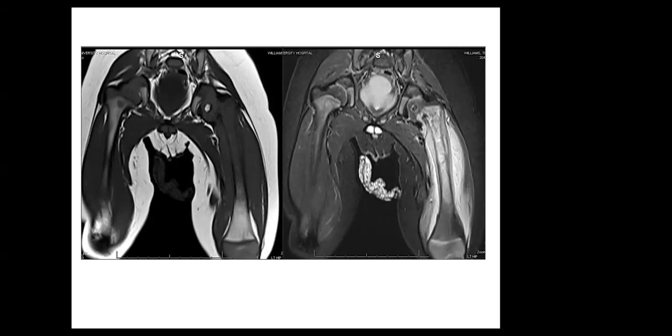Okay, we have 15 seconds left. Or infection. Okay. You want to make any recommendations? Doctor, if it is vitamin C deficiency, we need to refer the patient for clinical and lab correlation. Okay, so your time is up. We finished the 5 minutes.